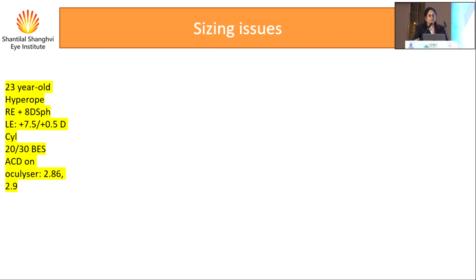As you know, we now also have phakic IOLs for hyperopic patients. Myopic patients, I think most of us are using it, and it's very simple, and most of us have good outcomes. But when you use it for hyperopes, as Sonu mentioned, the hyperopic patient would have a shallow anterior chamber, as we all know, and the vault of the lens is very critical.